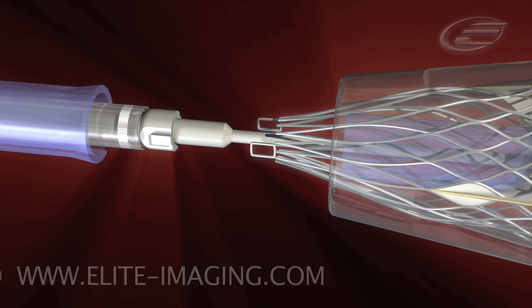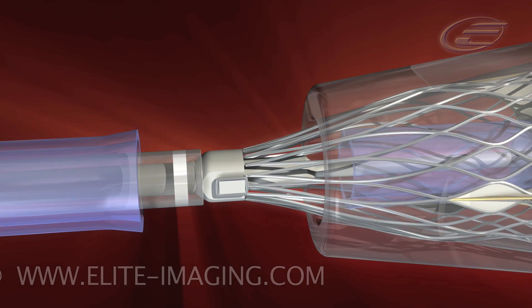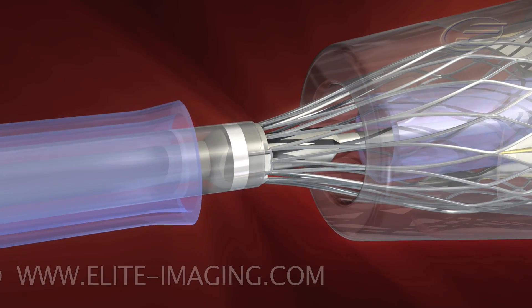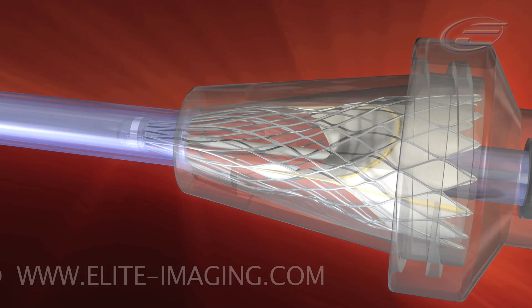Attach the frame loops to the tabs on the catheter deployment end. Cover the frame loops with the catheter sheath by using the micro-adjustment knob on the handpiece. Check that all the frame tips are securely covered inside the sheath.